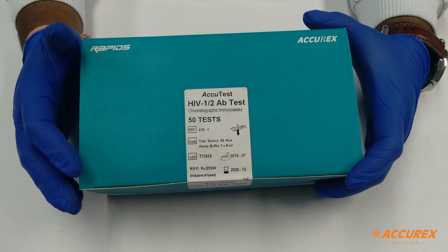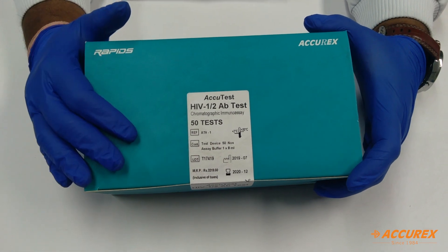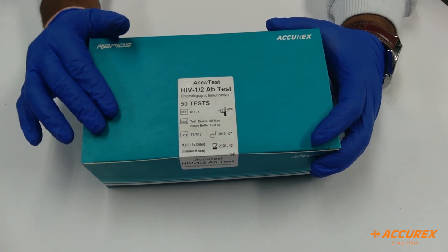Before moving to the testing part, we will see what precautions need to be taken and how to handle this product. We need to understand how to handle and store this product, and what precautions need to be taken for the testing part.